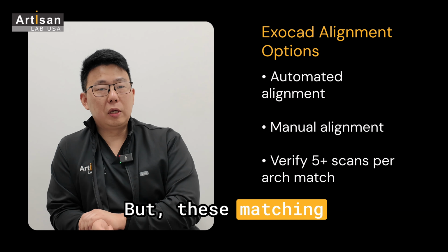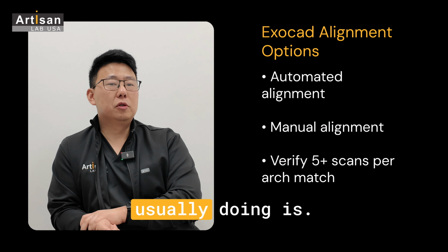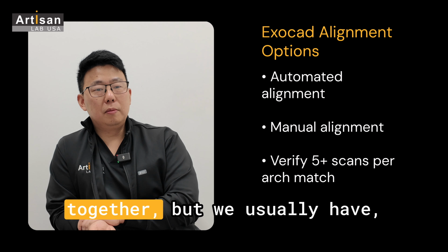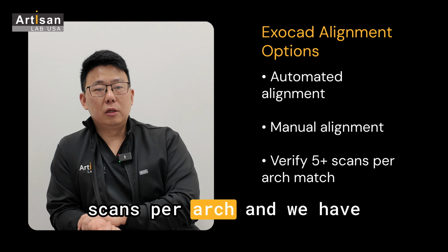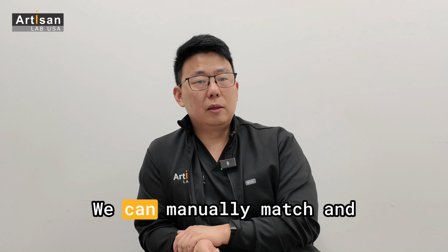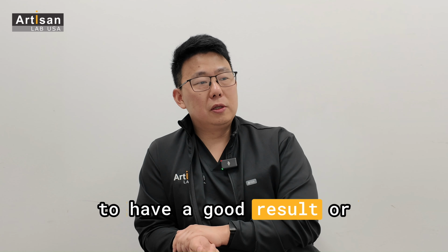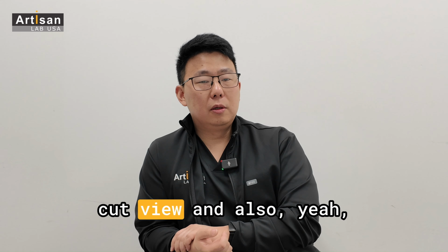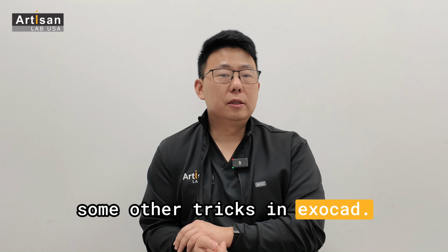In exocad, what we're usually doing is matching 2 scan data together, but we usually have, let's say, 5 different scans per arch. And we have to make sure all these scan data are matching well. We can manually match and also verify if it's going to have a good result or not using numbers, cut view, and also some other tricks in exocad.